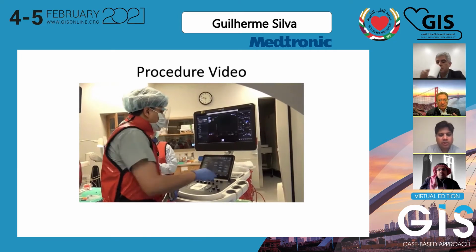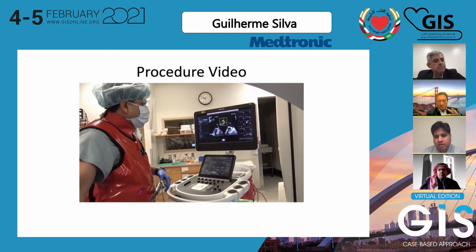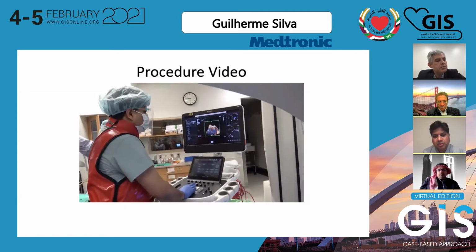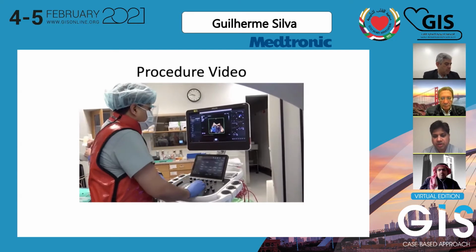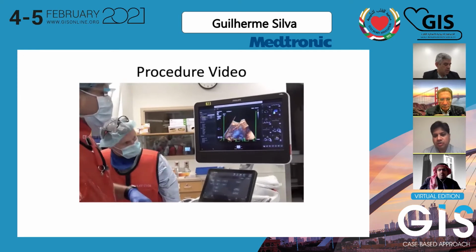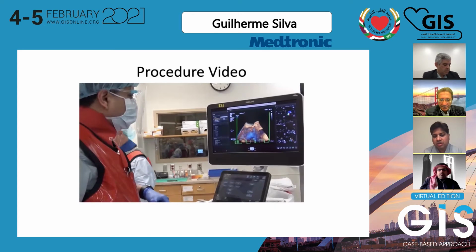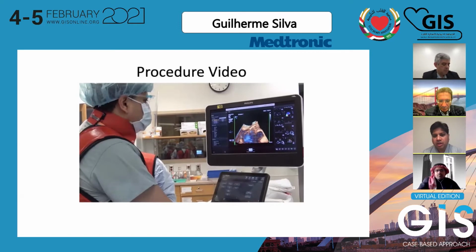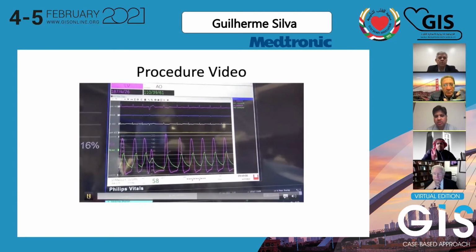Sorry, there were some technical issues before. Looking back to the echocardiogram and the parameters which Dr. Silva was showing earlier, you could see this lady was in atrial fibrillation, and with every beat her stroke volume was different, which makes it extremely difficult to assess the severity in these patients. With a smaller valve, every other beat you have a smaller stroke volume. And going back to the initial gradients he was showing, the mean gradient went in every alternate beat close to 72 mmHg. So it shows how significant it is.